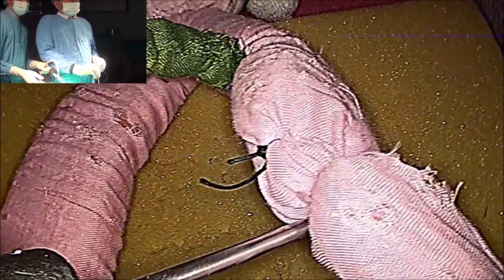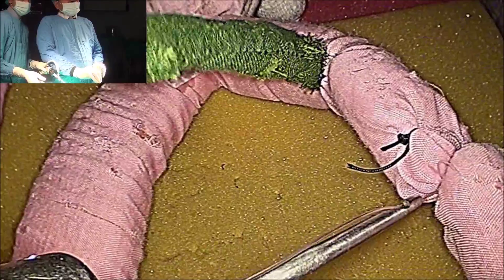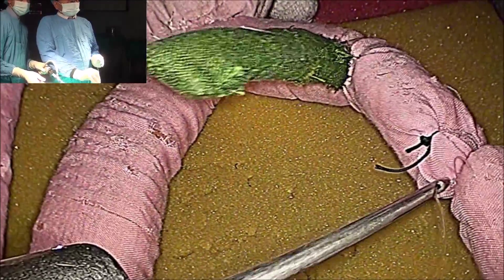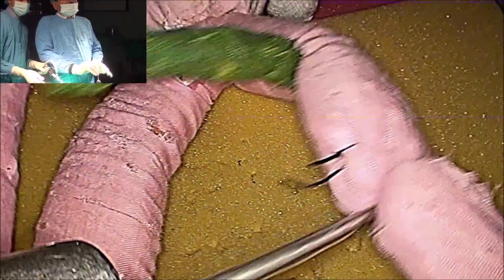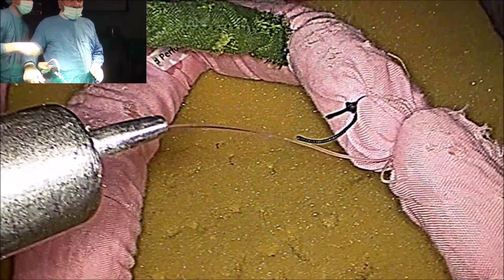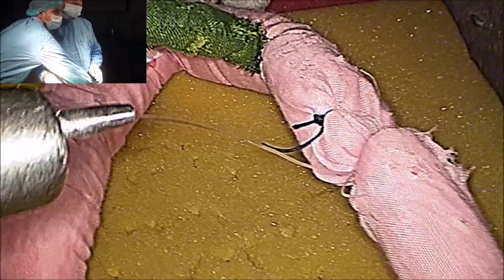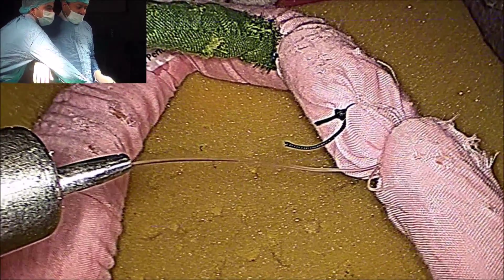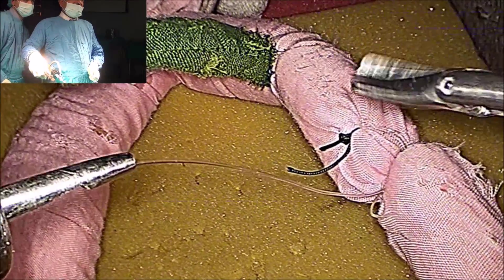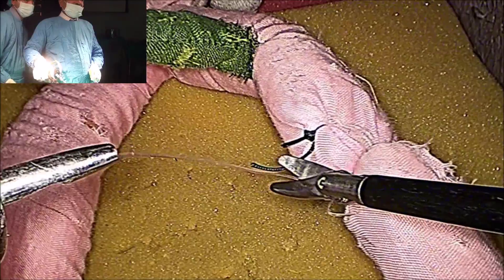One — rotate it. Two — rotate it again. Try to rotate so that it will not get entangled in the eye. And three — you have to tighten it three times. It is very secured. It doesn't slip because it gets snugged with the tissue. Once it is snugged with the tissue, it is not going to slip. Then cut it.